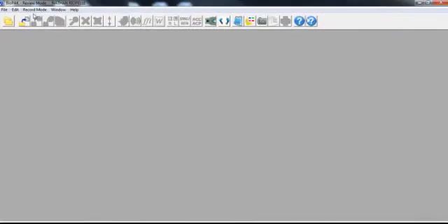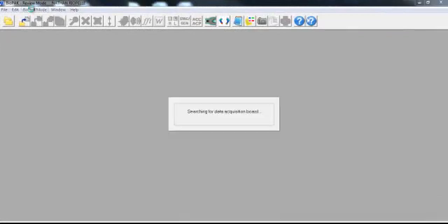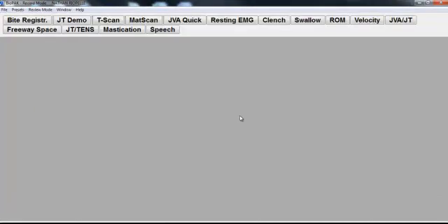So now when I pull up Record Mode here, it searches for the data board on the JVA, and then we have all of our tests here so we know now that that's working.